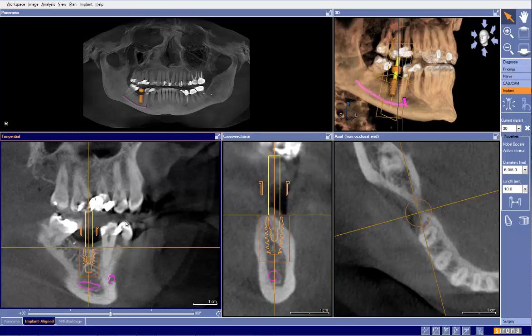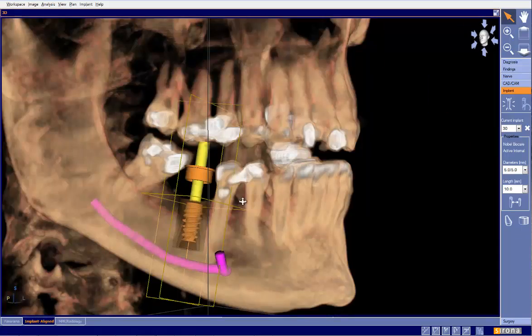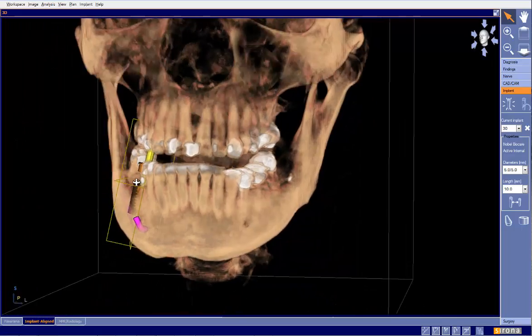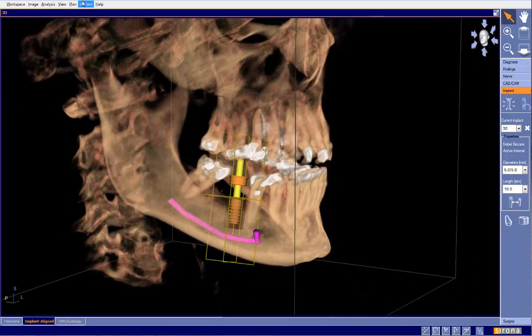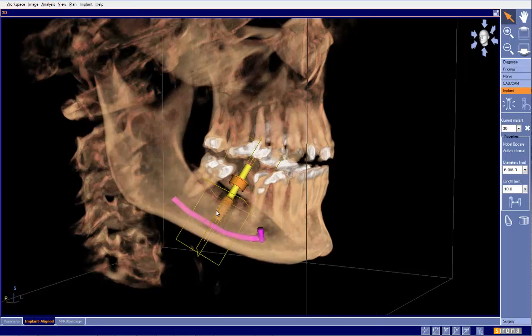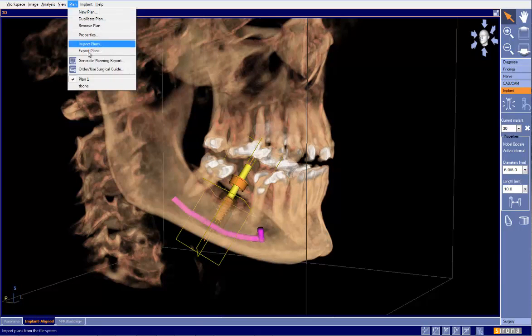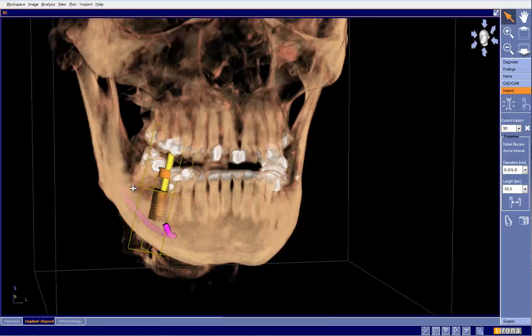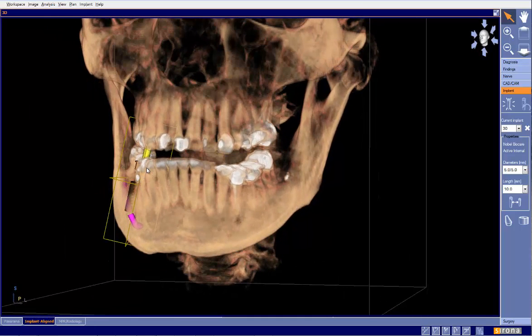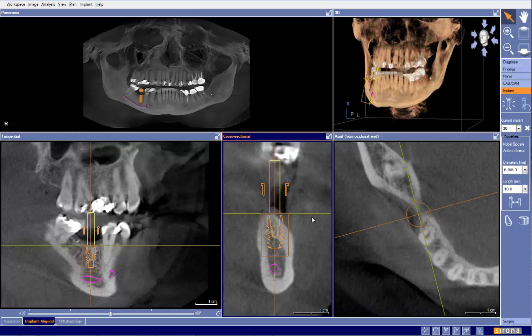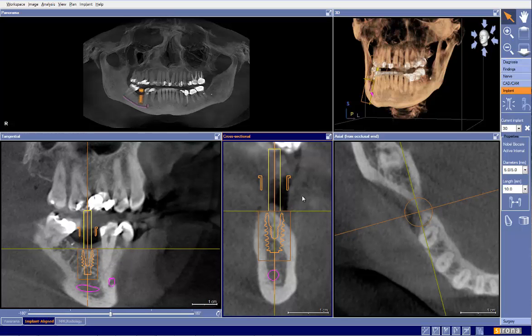Here we can see the difference. Another thing I like to point out is just looking at the jaw in general — how does this implant look in comparison to the adjacent teeth? You can see the original implant is quite a bit tilted, whereas mine looks like it more belongs going straight up and down. Looking down the line, we can see the implant axis is tilted as the lower molar would naturally be tilted. This case is relatively straightforward in terms of placement. It does require a little bit of grafting on a few threads, which can be done prior to or at the time of implant placement. Thank you for submitting the case.